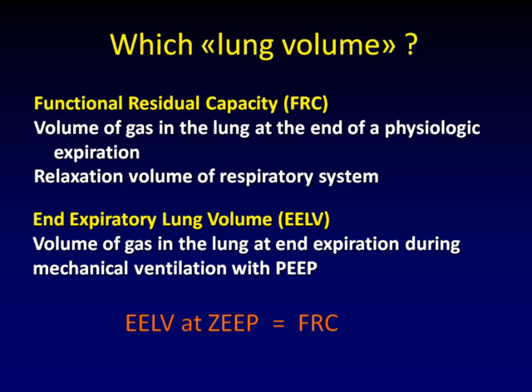The title of my speech is about the use of lung volume measurements to measure recruitment or derecruitment. What kind of lung volume are we talking about? We may talk about functional residual capacity, which is the amount of gas inside the lung at end expiration at zero pressure.